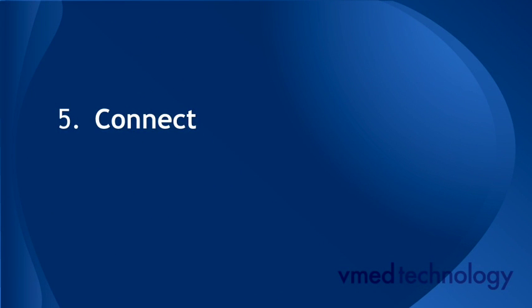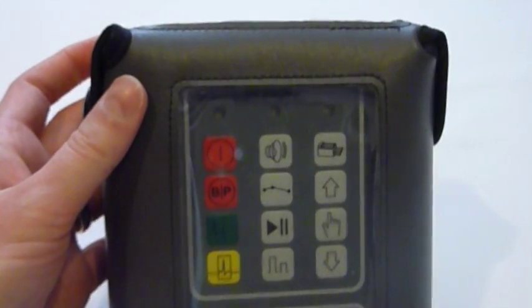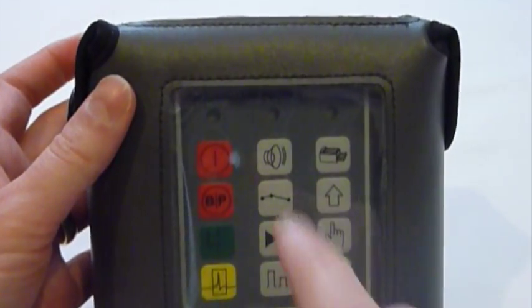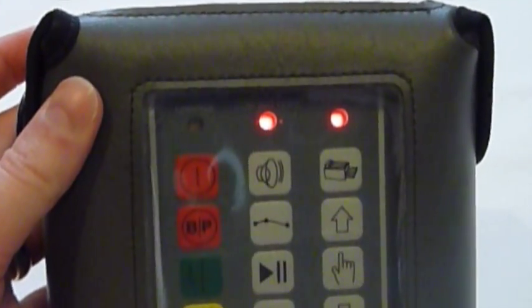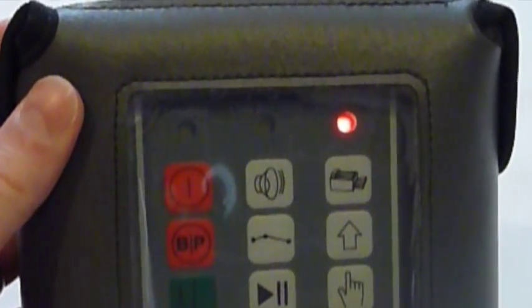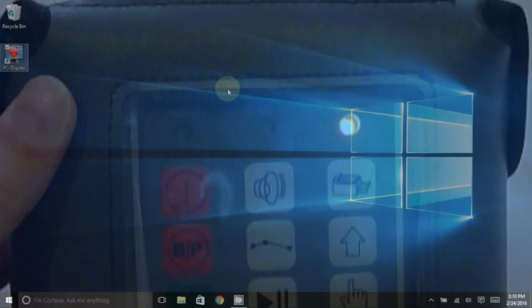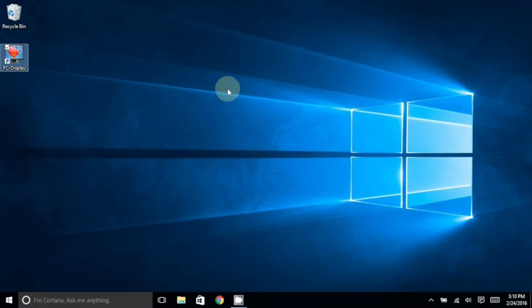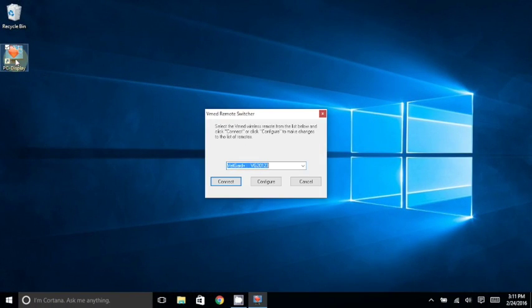The final step is to connect your VMED wireless remote. First, you will make sure that your VMED remote is turned on, and its connection light is amber or yellow. Then, open PC Display.